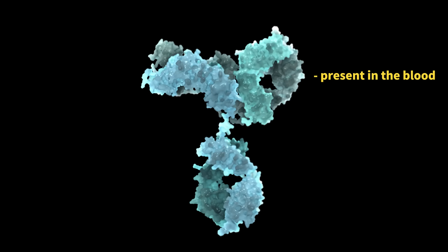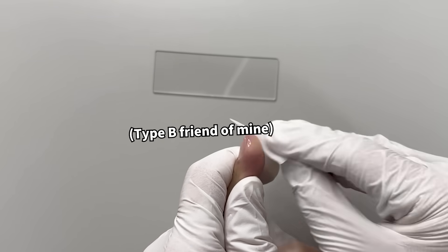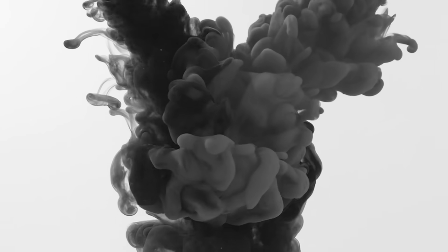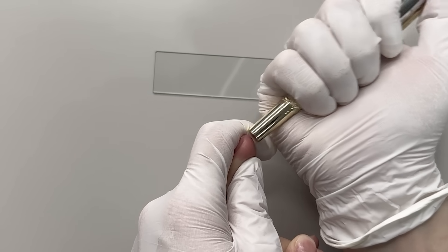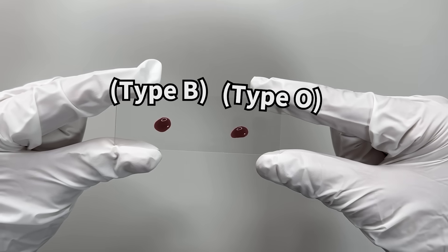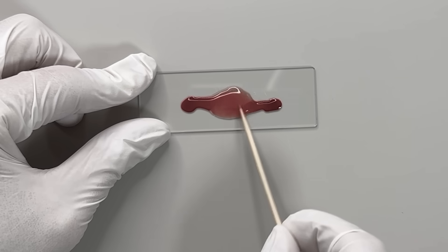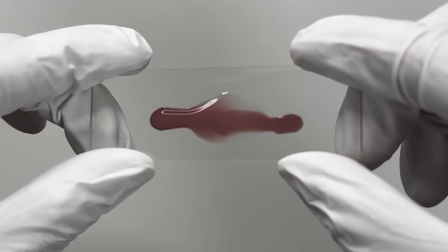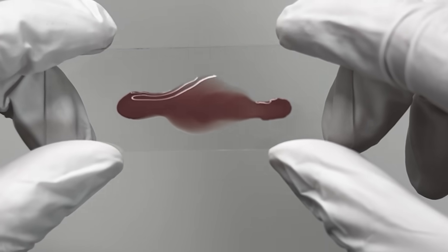Since these antibodies also exist in our bodies, a similar reaction might occur when we mix blood of different types. To verify this, I mixed the blood again, added some saline solution, and observed. Initially, it didn't seem to solidify as strongly as it did with the reagent.